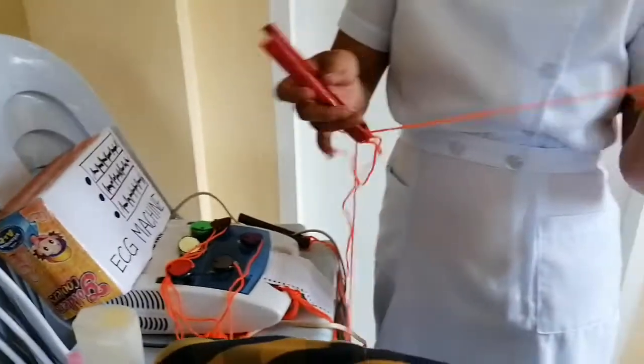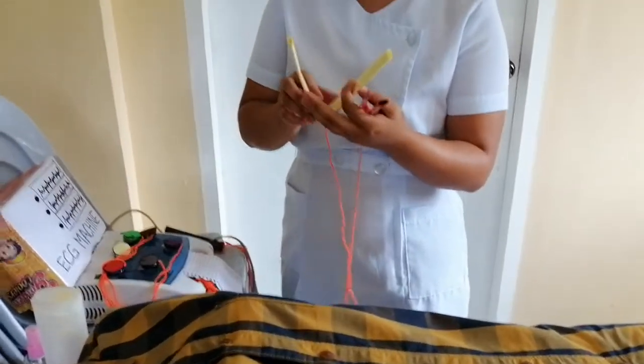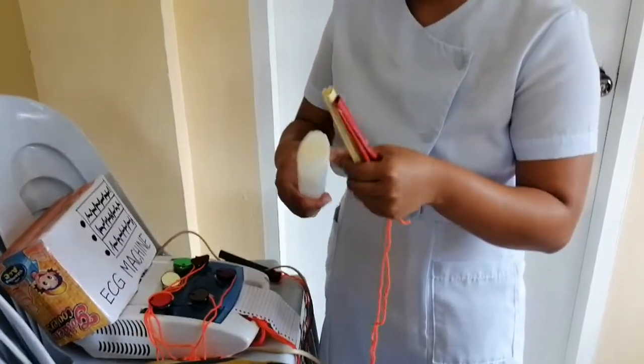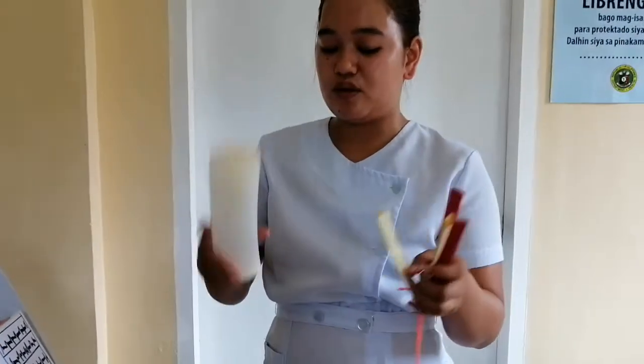I'm now going to place the limb leads of the ECG machine. But before that, we're going to apply electrogel.